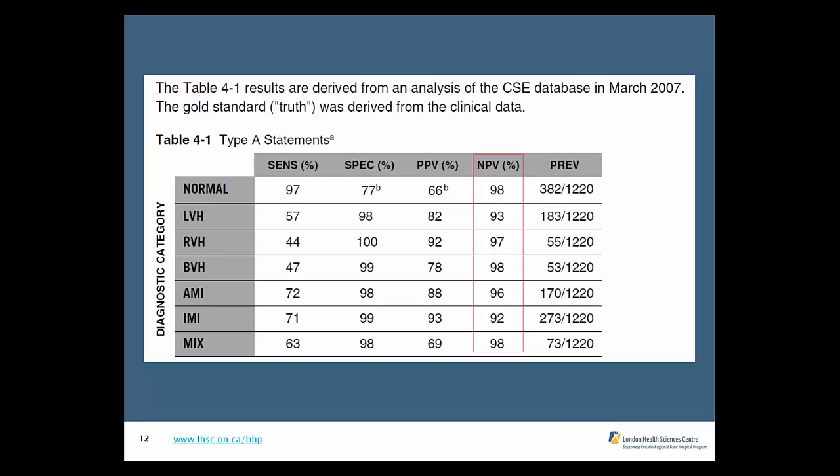You're the one who has the patient in front of you, has taken the history, knows the patient's past medical history, and is hearing the description of what is going on, and then using that ECG as a tool to either increase your suspicion: yep, this algorithm is correctly identifying this as a STEMI, I'm looking at it, I agree, and the patient is diaphoretic, having an elephant sitting on his chest pain, says it feels like the MI he had 5 years ago. This is an MI occurring.